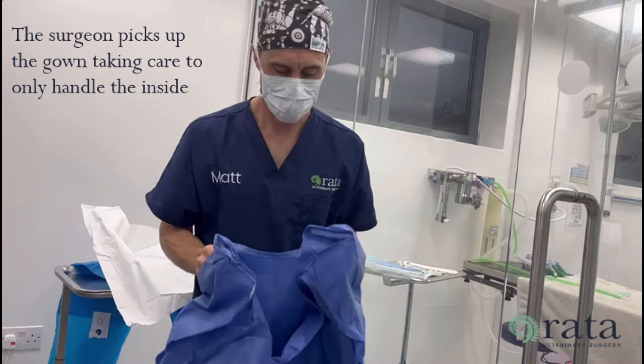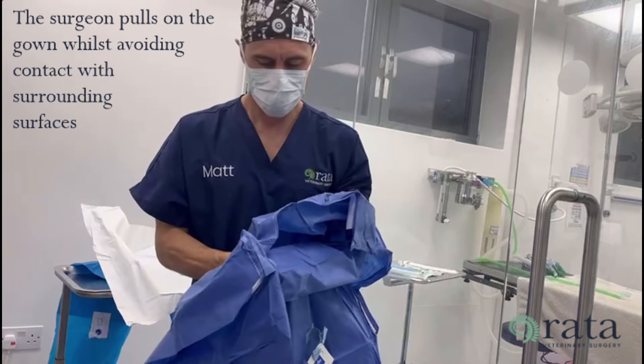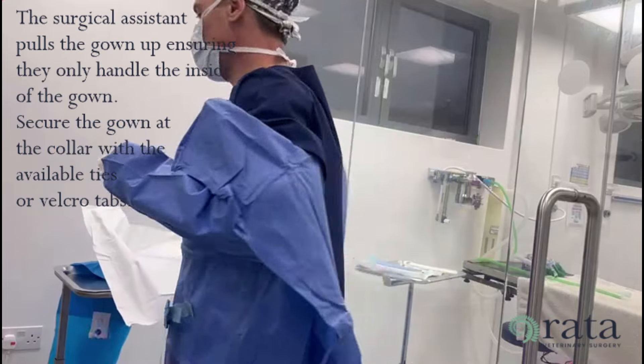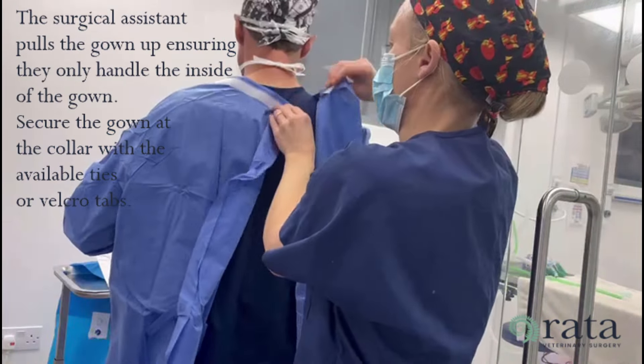The surgeon picks up the gown taking care to only handle the inside. The surgeon pulls on the gown whilst avoiding contact with surrounding surfaces. The surgical assistant pulls the gown up, ensuring they only handle the inside of the gown.